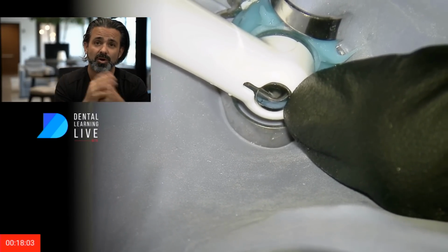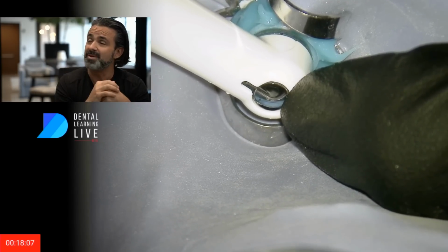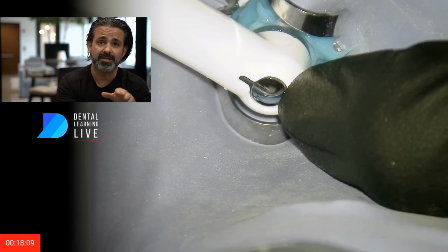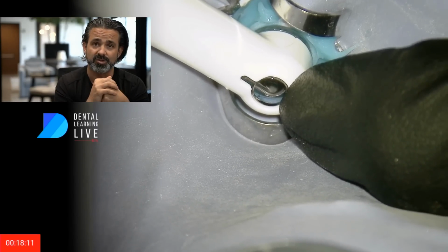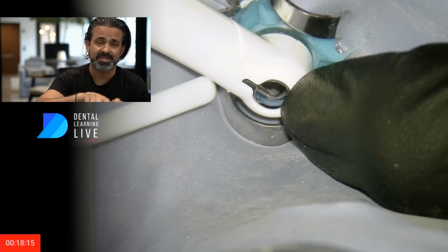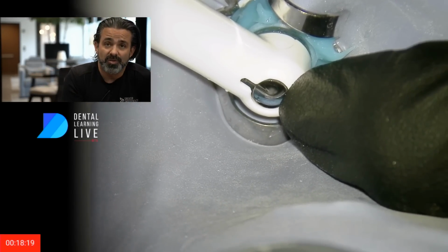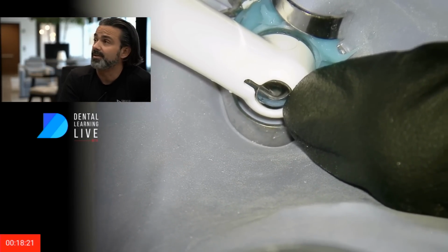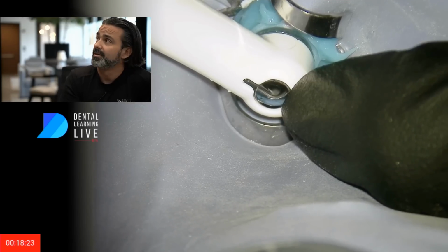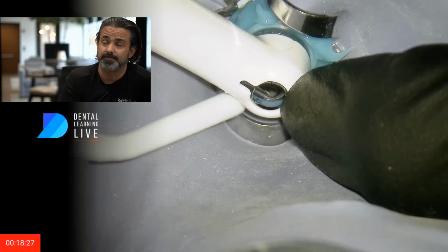And so I decided along the way, sometimes you can stop a few minutes into the cycle and then try to navigate and get your length. But I was so worried about this fork being so steep, such a steep angle as it comes in, that I chose to run the whole procedural instrument cycle on it. So it's going to get the full force of the wave on this one. I wasn't going to mess around.